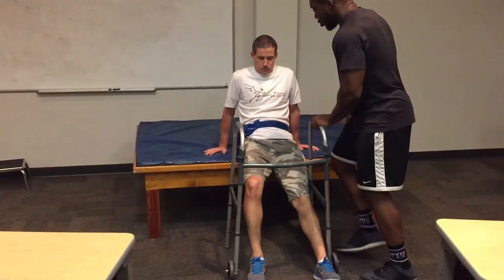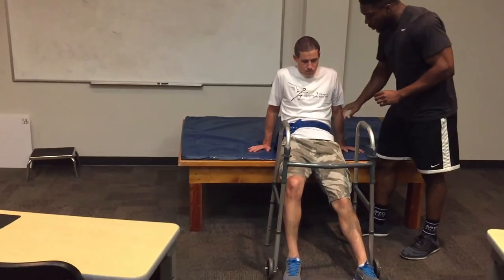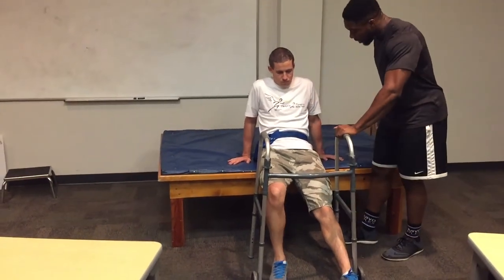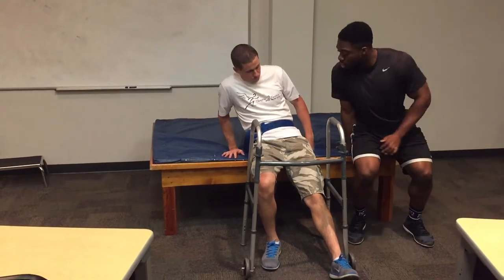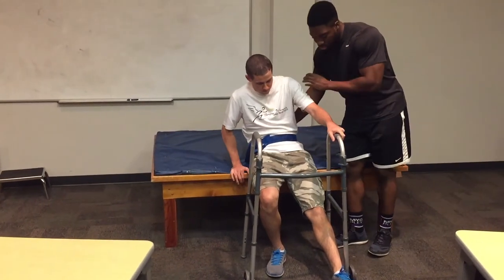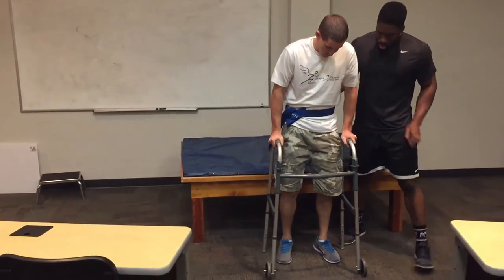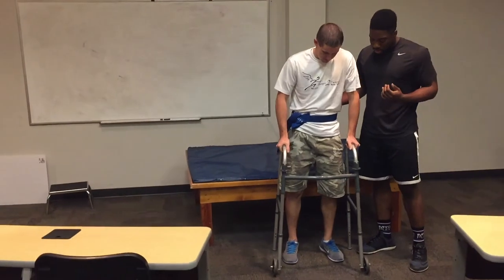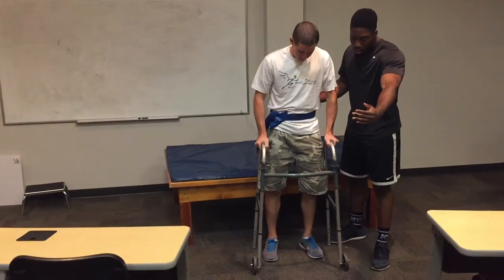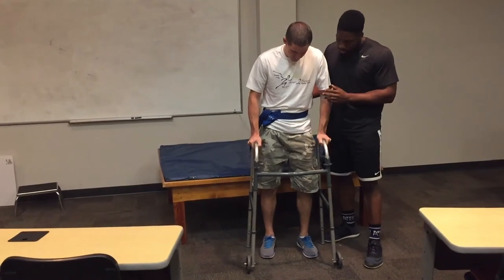Possible here. So what you're going to do is shift to your right side, so that's the strong side, and you're going to go ahead and grab with your left hand here and push. You're going to push off with your right, the strong side, right side. Okay. And we're going to support you here. There you go. And then as we ambulate here, you're going to bring the walker out first, and then you're going to step with that weak side and then your strong side. Okay.